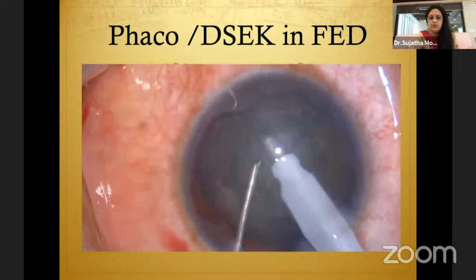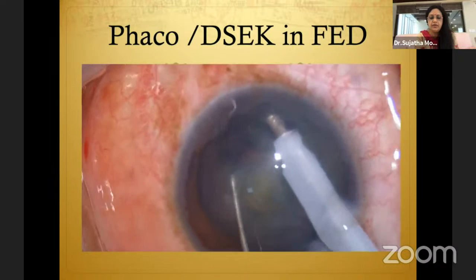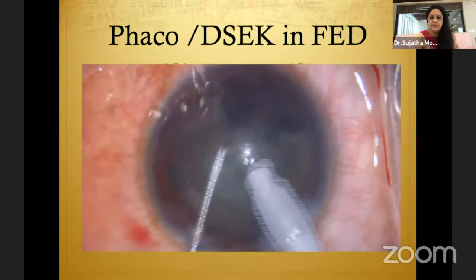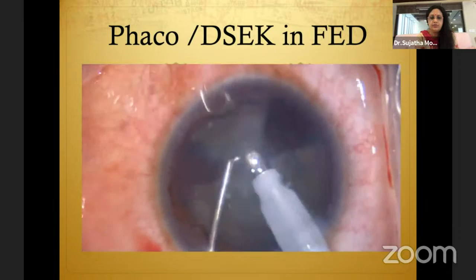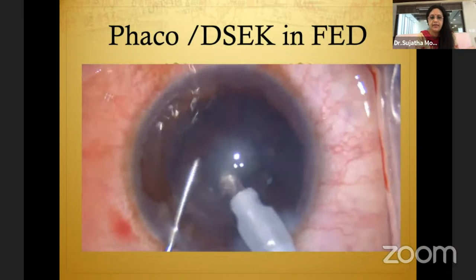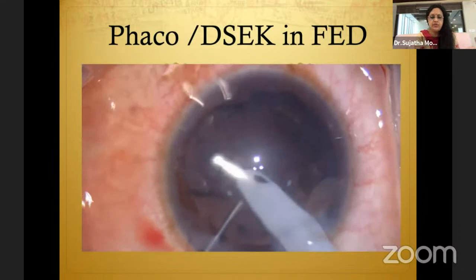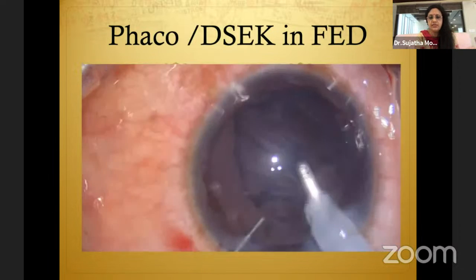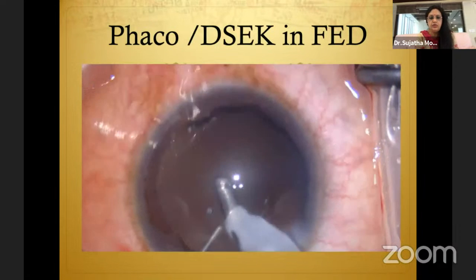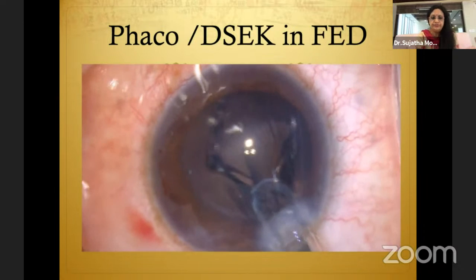I use an anterior chamber chopping technique. I chop in multiple pieces, and then I emulsify all the pieces one by one. I don't remove the pieces as we chop; that is usually my technique. Once it is done, I do an IA. Fortunately, you can see that the visualization is excellent in this patient after removing the epithelium. And then you implant an intraocular lens in the bag.